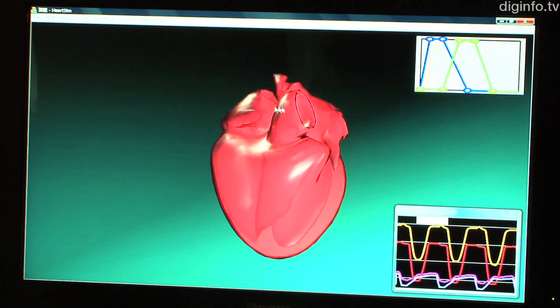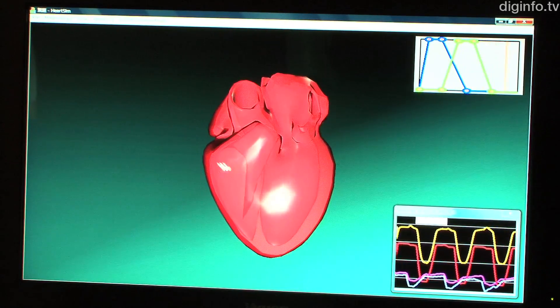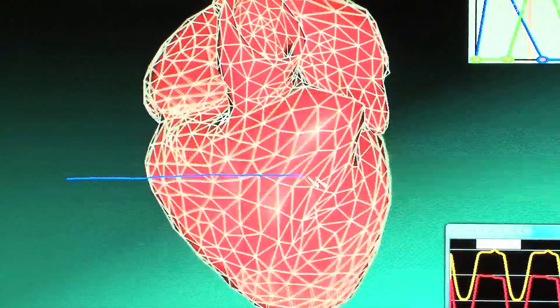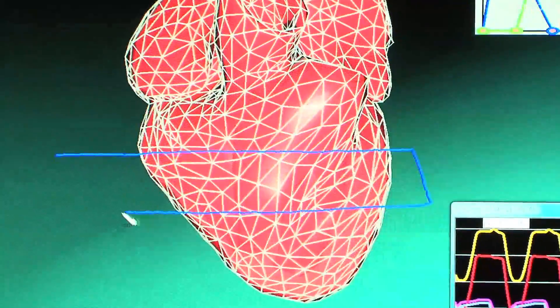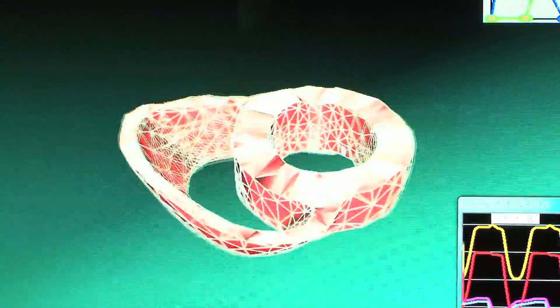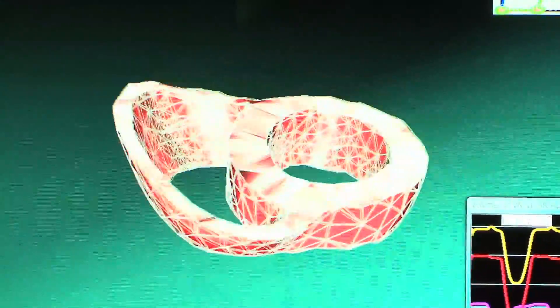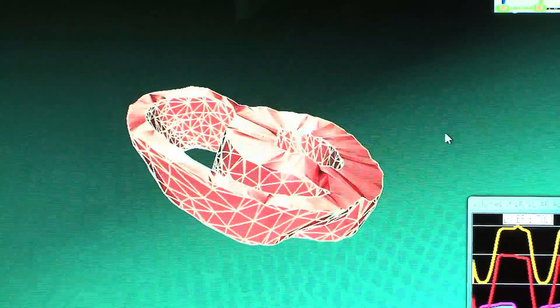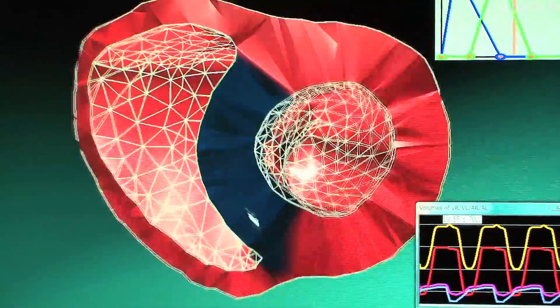It's possible to deform the heart by applying tension and to observe cross-sections. Additionally, heart attacks can be simulated by stopping the motion and painting a region. This also makes it possible to create virtual heart disease.